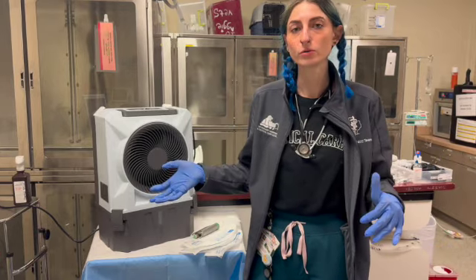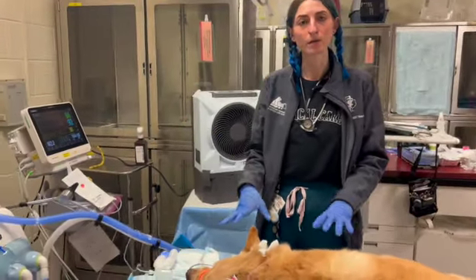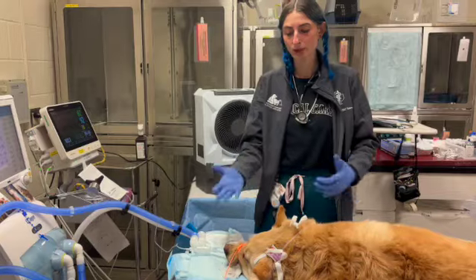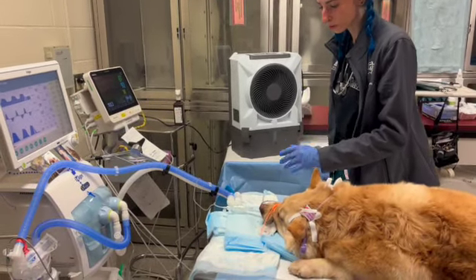Demonstrate how to utilize all of our anesthetic monitoring. So this patient has already been anesthetized and is obviously intubated. So we'll just go ahead and start with endotracheal tubes.